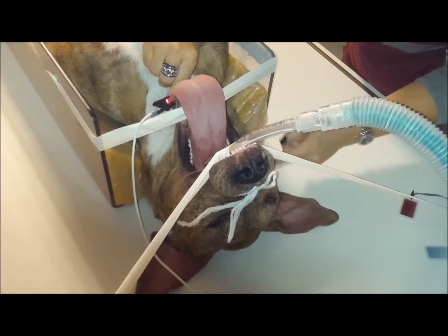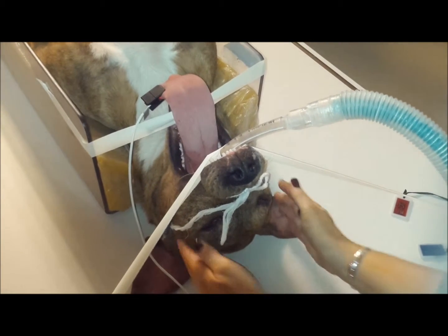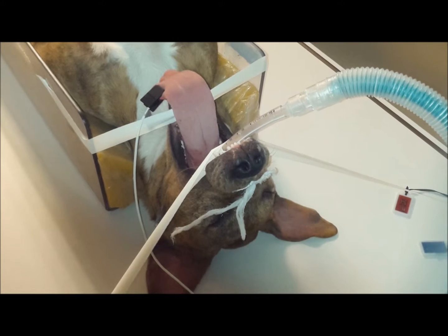You're going to measure at the commissure of the lip, and of course you're going to come down to the end. You're going to check for straightness. He is not — he's tipped. That's better. Always check from the end.